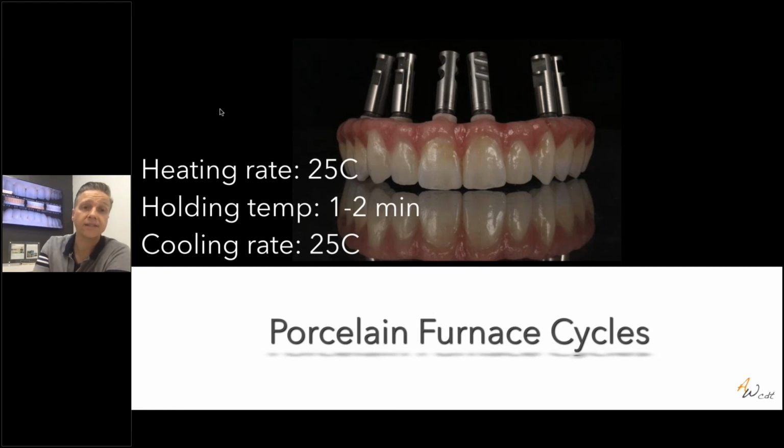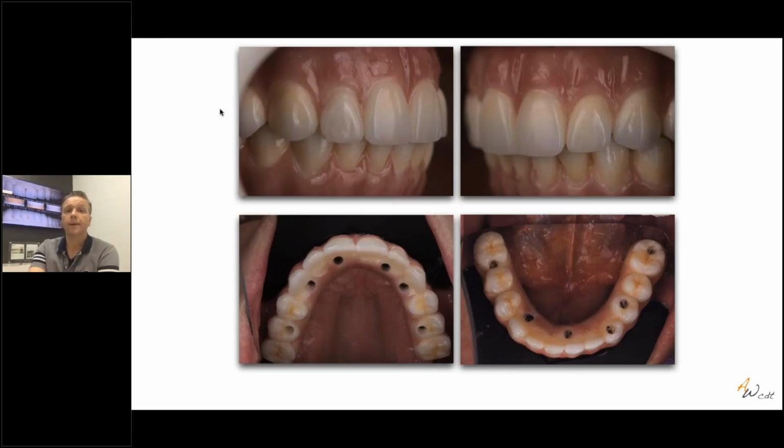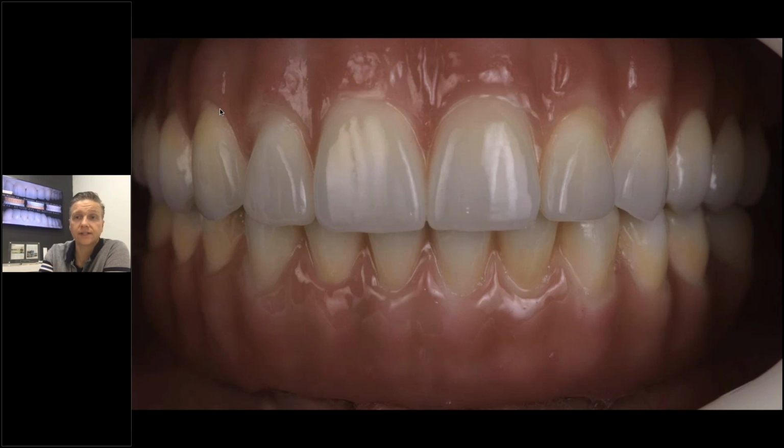And that's the final case, just a full contour zirconia, full mouth rehab on implants. The anteriors here are a little bit layered in the upper. The lower is full contour, just glaze and stain. Just some impressions.